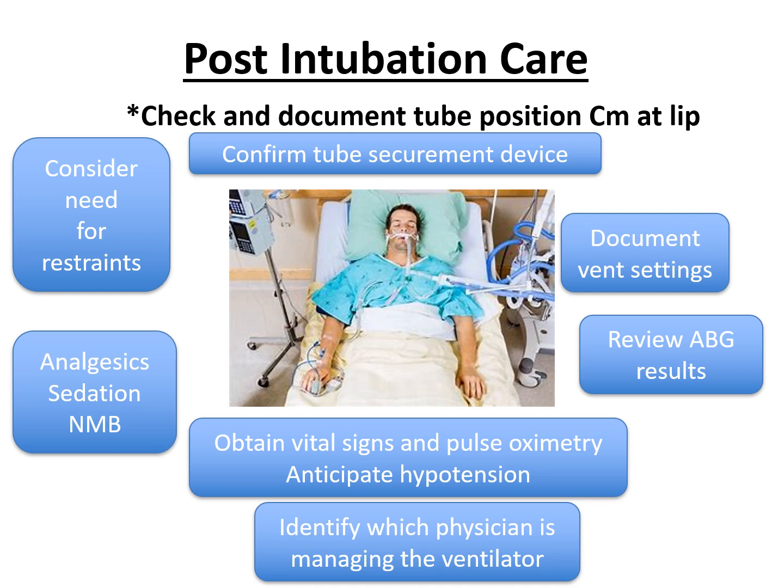You are definitely going to want to obtain vital signs and pulse ox, and you're going to monitor that patient. And I want you to understand that you're going to see hypotension, so anticipate that. You can treat that hypotension with a fluid bolus. Patients who are intubated go from negative pressure to positive pressure. That positive pressure increases intrathoracic pressure, which can decrease blood return to the heart, and therefore decrease cardiac output and cause hypotension. It takes a little while for the body to readjust to that change in pressure, but in the meantime, if your patient is hypotensive, you can give them fluid boluses to correct that.